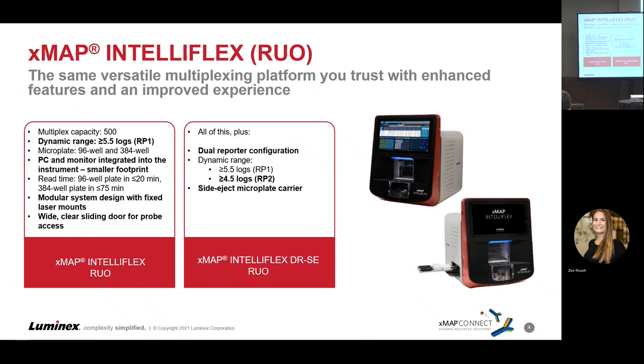It can handle 384 and 96 well plates, just like the FlexMap 3D. This instrument, however, has an integrated PC and monitor built into the machine. Everything you see here is all-encompassing — there's no longer a need for the SDS on the side like the LX200, or the separate PC and monitor like the legacy instruments have. Everything is included in this platform.